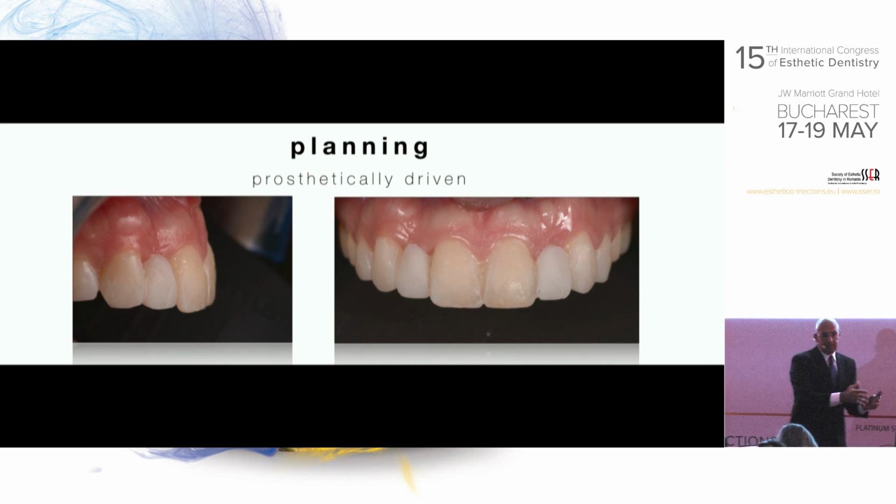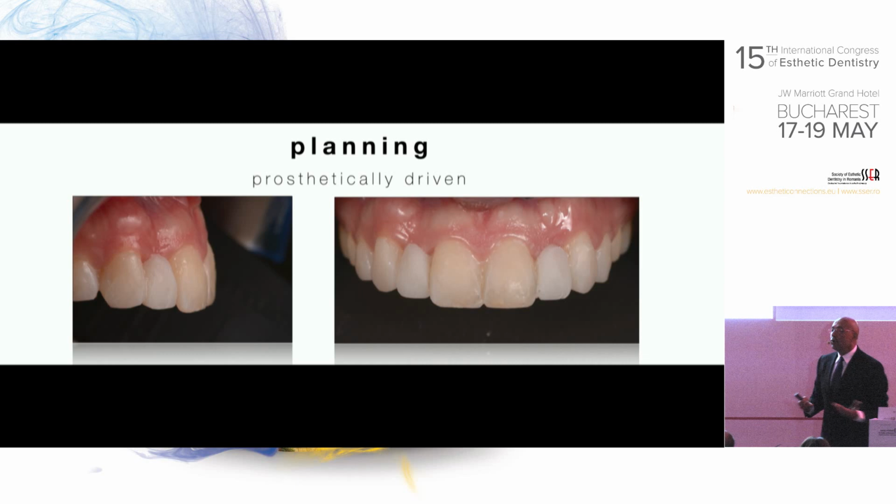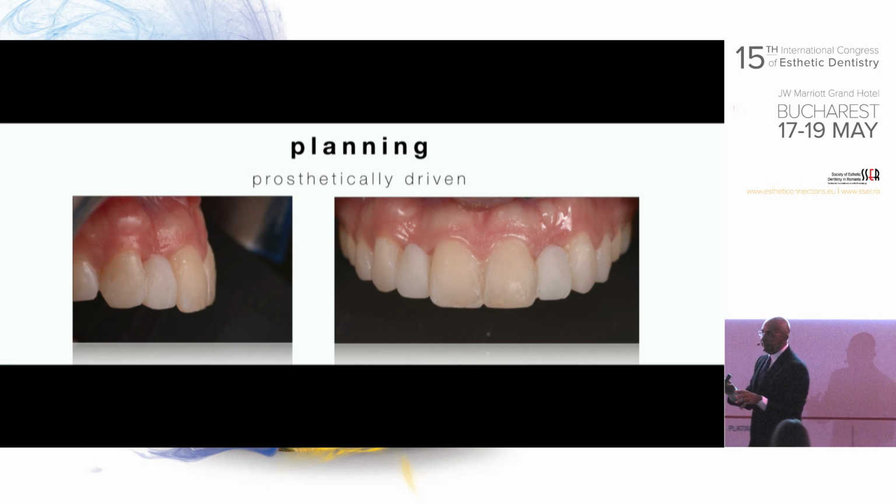Osseointegration is different than the aesthetic integration, because now I can control whether it will be screwable or not, or whether I have to go with cementation, whether it's going to fit with the position of the teeth or not. This is all the planning we make in advance.